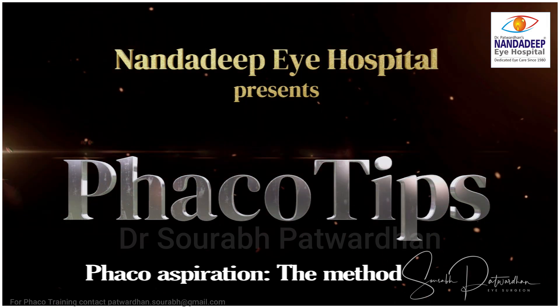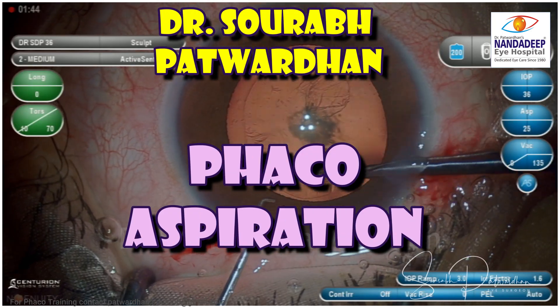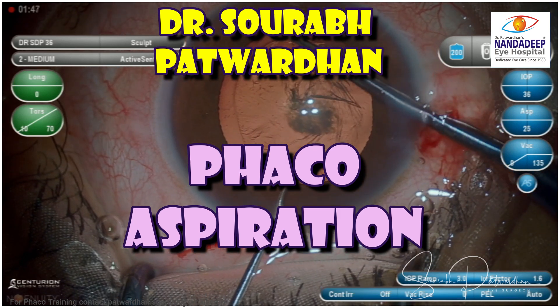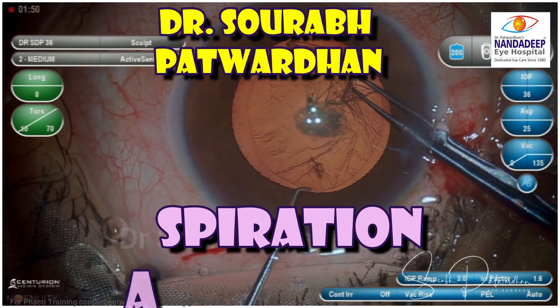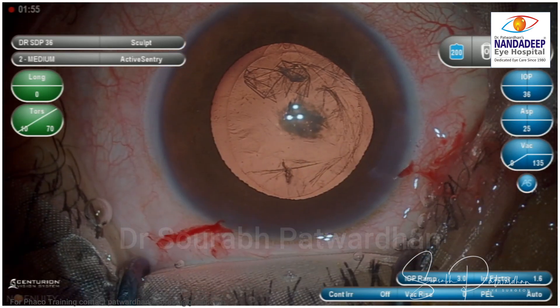This video is part of FACO TIPS 3D teaching course. In this video I am going to speak about the perfect method for doing FACOaspiration. This is an excellent technique for softer grade of cataract, particularly grade 1 or less.